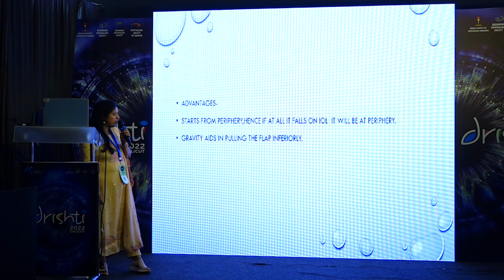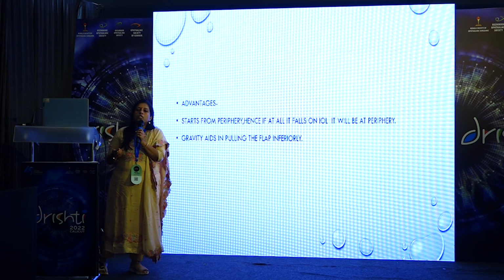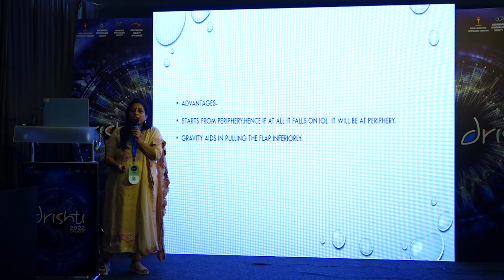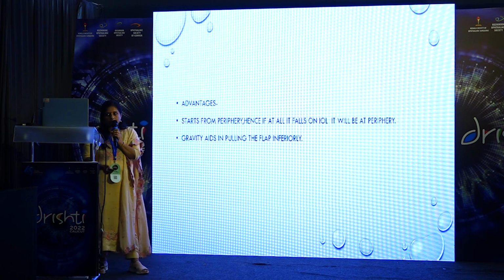The advantage of a cruciate pattern is that it starts from the periphery. So if at all an IOL pitting or something happens, it happens in the periphery. And also you have the advantage that gravity will pull the flap down and you'll have an inferiorly based flap, which will avoid the patient getting floaters later on.